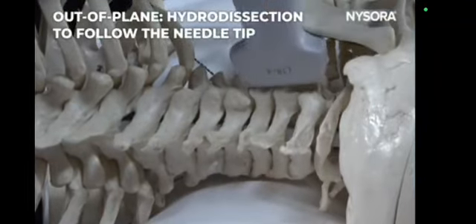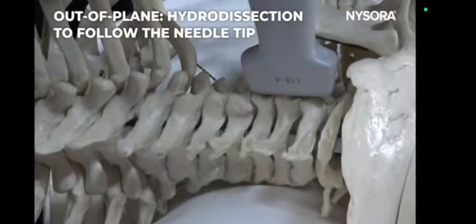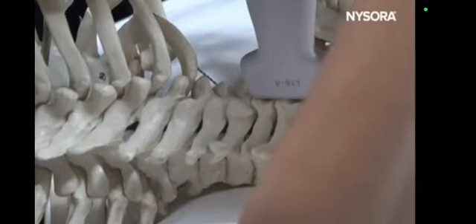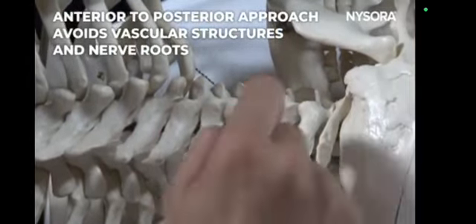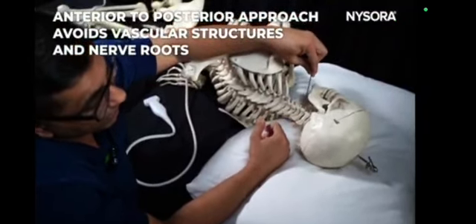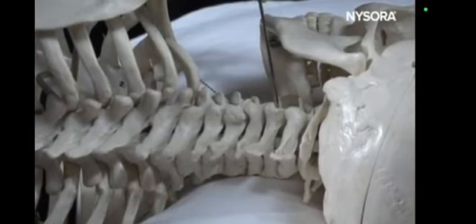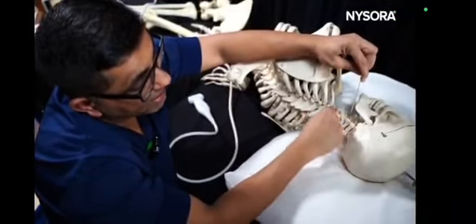When you talk about the out-of-plane technique with the longitudinal approach, you have to use hydrodissection to make sure you chase your needle tip. Clinical tip here, or the pearl I would like to tell, is you always go from anterior to posterior. Why? Because when you go from anterior to posterior, you're avoiding all the important structures, including the carotid artery, vertebral artery, and nerve root. You will be bringing the needle from anterior to posterior, landing into that trough. Now, if you miss the bony target, you will still be safe because you will end up in the posterior cervical paraspinal muscles.